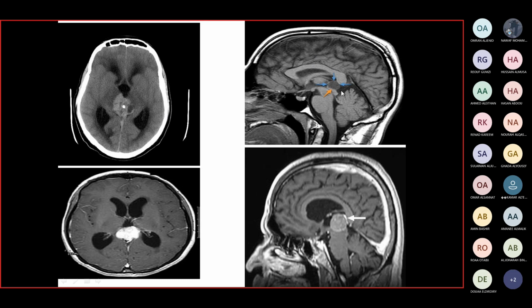What is this imaging modality? I believe that's MRI as well. Yes, this is MRI. Which plane? Sagittal MRI. Yes, what is the area of this abnormality? It's the pineal gland. This is a tumor in the region of the pineal gland. Describe this lesion using the terminology used in MRI. It's isointense. It's a midline structure placed between the thalami and posterior to the third ventricle. Yes, you are right.